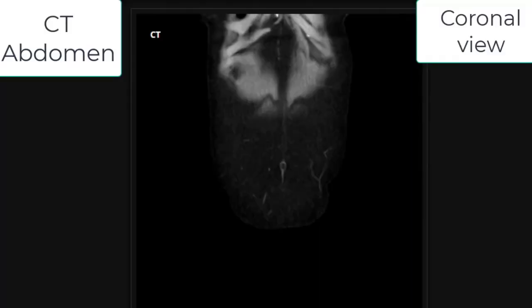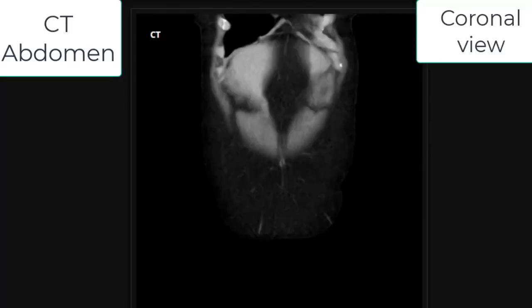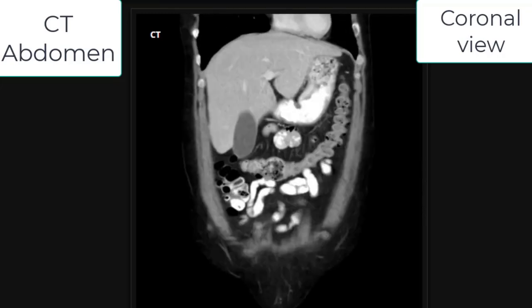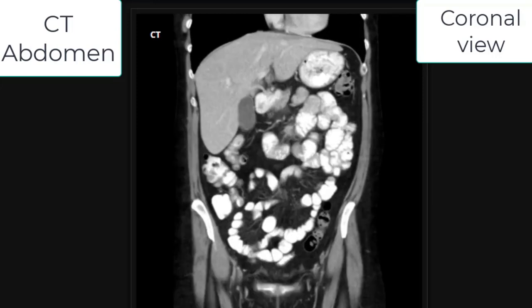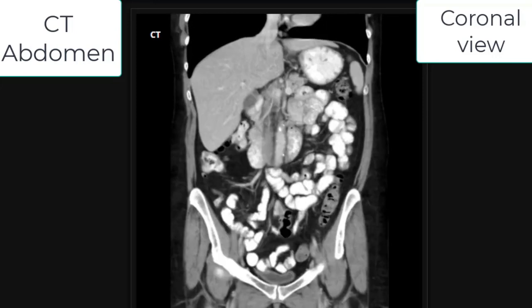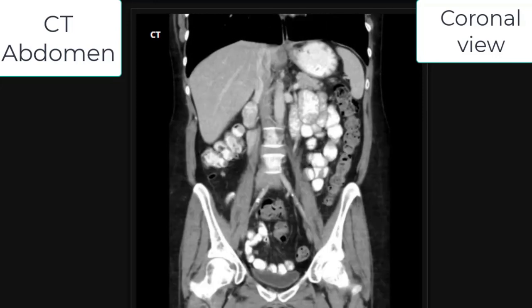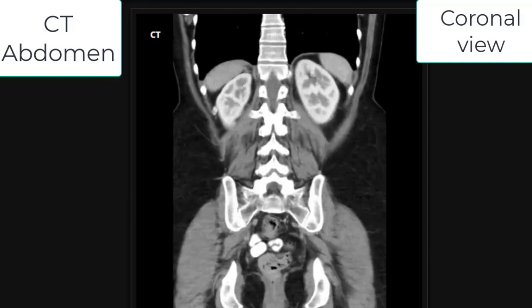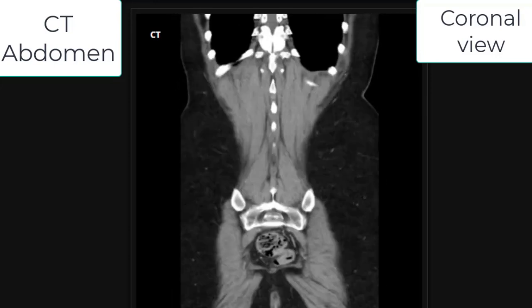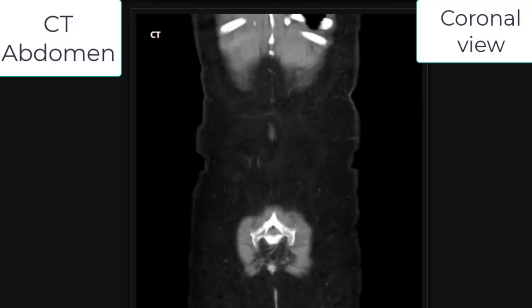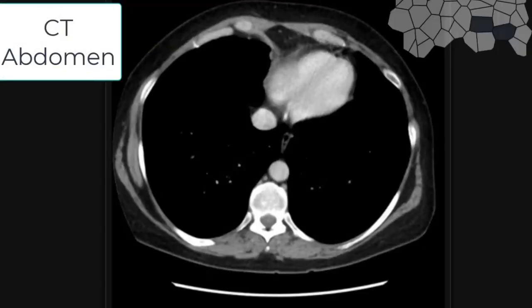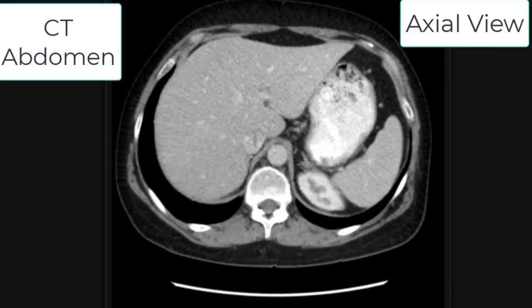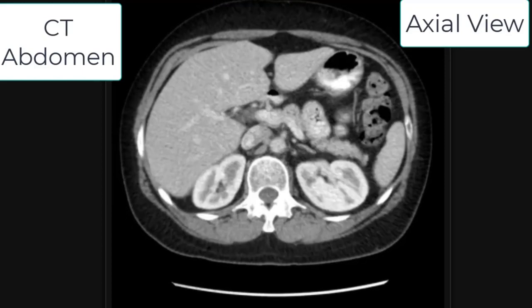Now we will look at some CT scan views. This is a CT abdomen in coronal view, also called the anterior-posterior view, showing the liver and other abdominal structures, as well as the kidneys and the vertebral column. This is very important for CT examination of the abdomen.